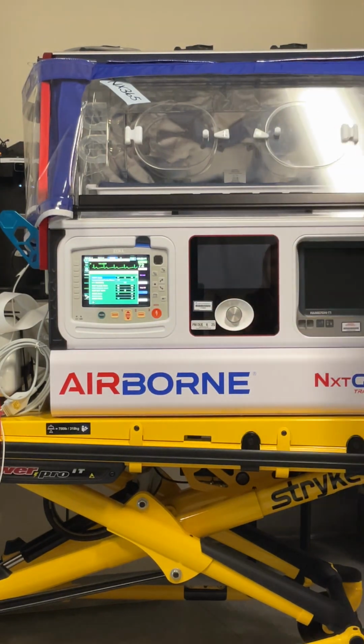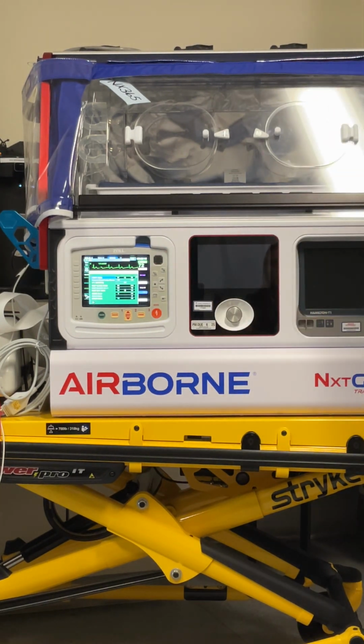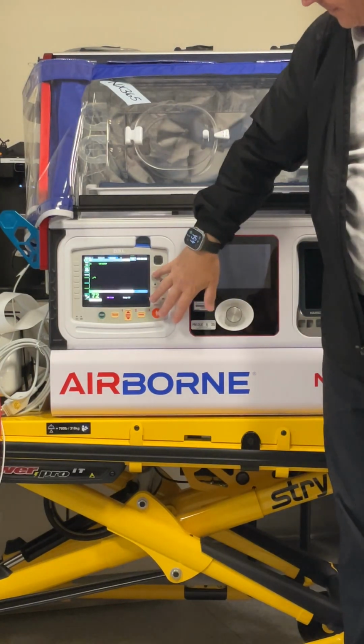So get everything hooked up, come in here, hit stat set. And then if something changes and maybe now baby's heart rate comes down a little bit and you're comfortable with where it's at and it's now alarming at you, just come back in here and hit stat set again and it'll readjust those alarm parameters. It's like the optimize button. Make sense?